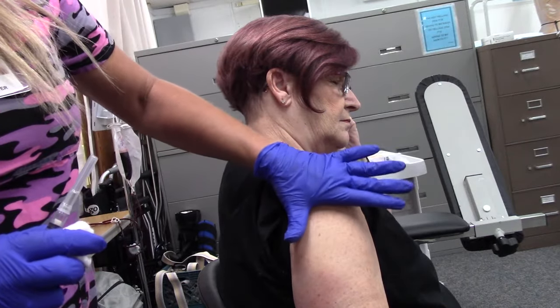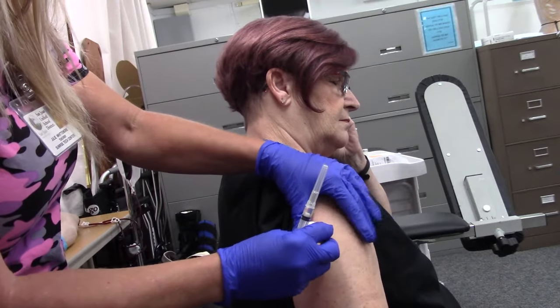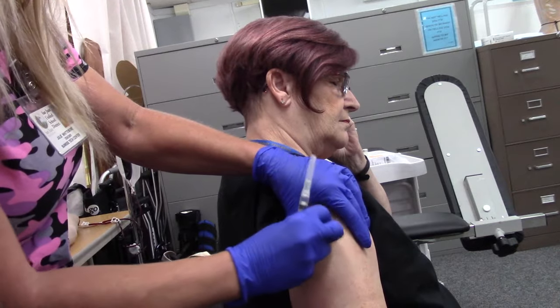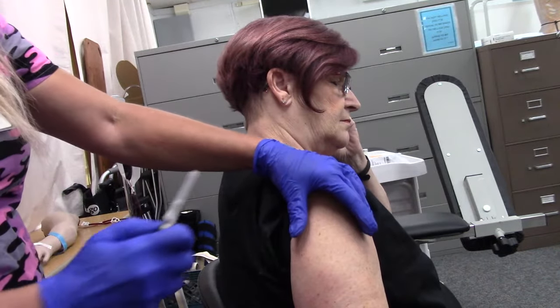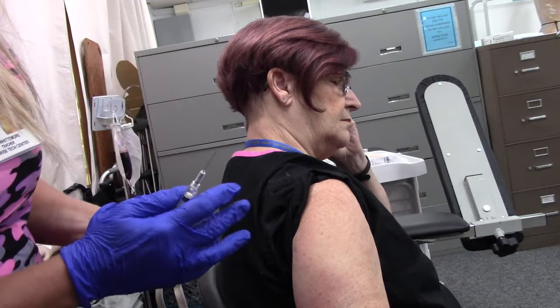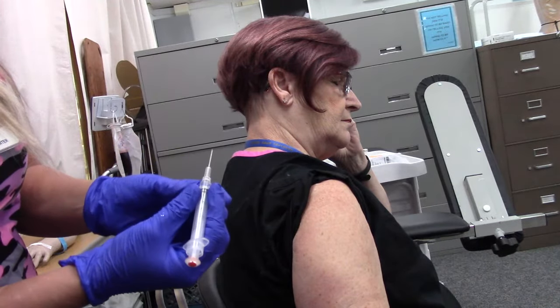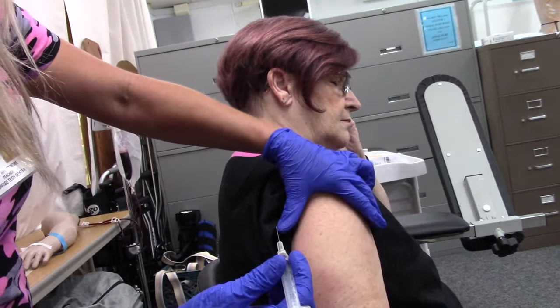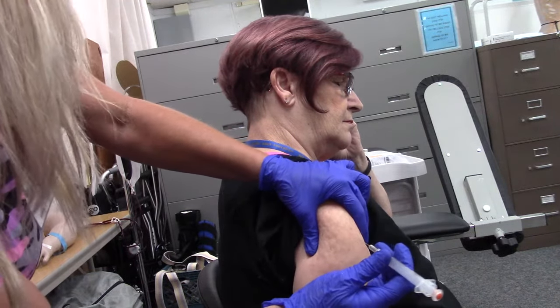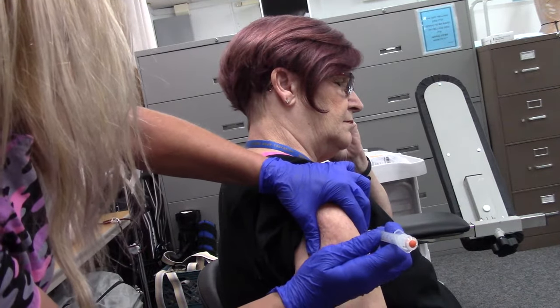Right here is the deltoid, so I'm going to go ahead and clean that space. We're going to grab and hold that muscle, letting it dry. Bevel is up — we're going to grab that muscle. I always end up resting on the body for stability, then straight in.